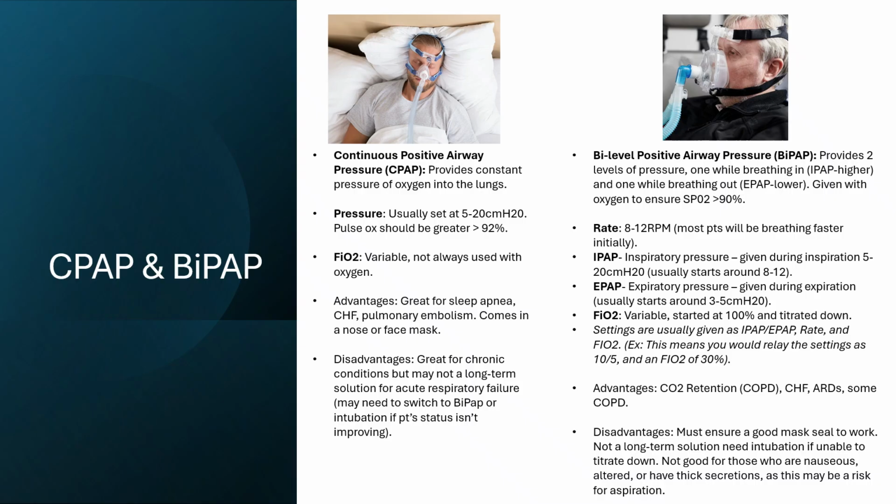It's, again, not a long-term solution. They might need intubation if you can't titrate them down off of your FiO2 or your pressure settings. And it's not good for those who are nauseous, or if they're altered mental status, or they have thick secretions, because that could certainly put them at risk for aspiration.